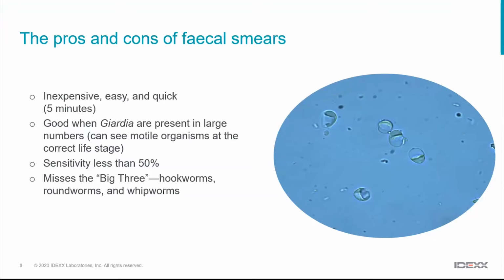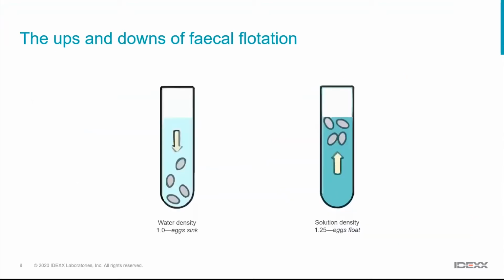And if you're concerned about giardia, it definitely has value. And if we get a positive, it tells us that that's what they've got. But a negative does not rule out the possibility of giardia.